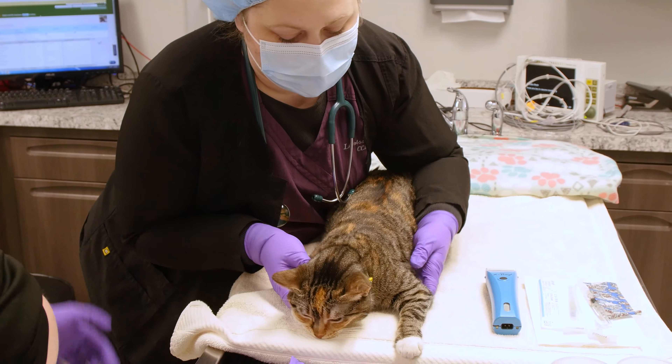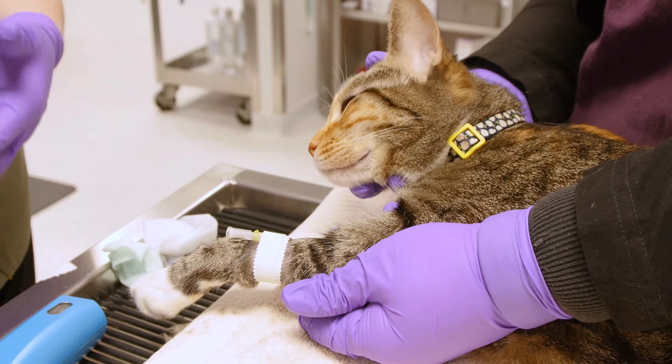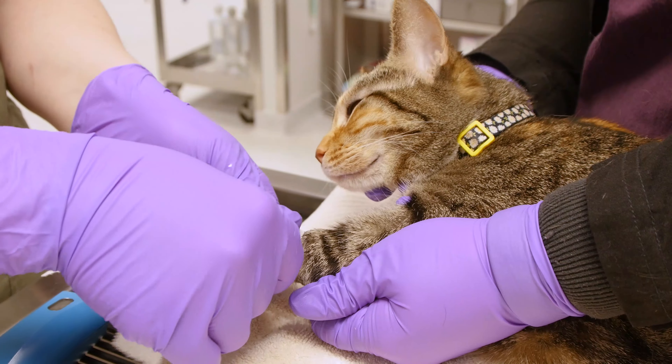After the sedation has taken effect, we will place an IV catheter. The IV catheter allows intravenous access throughout the surgery, and IV fluids are administered as well.